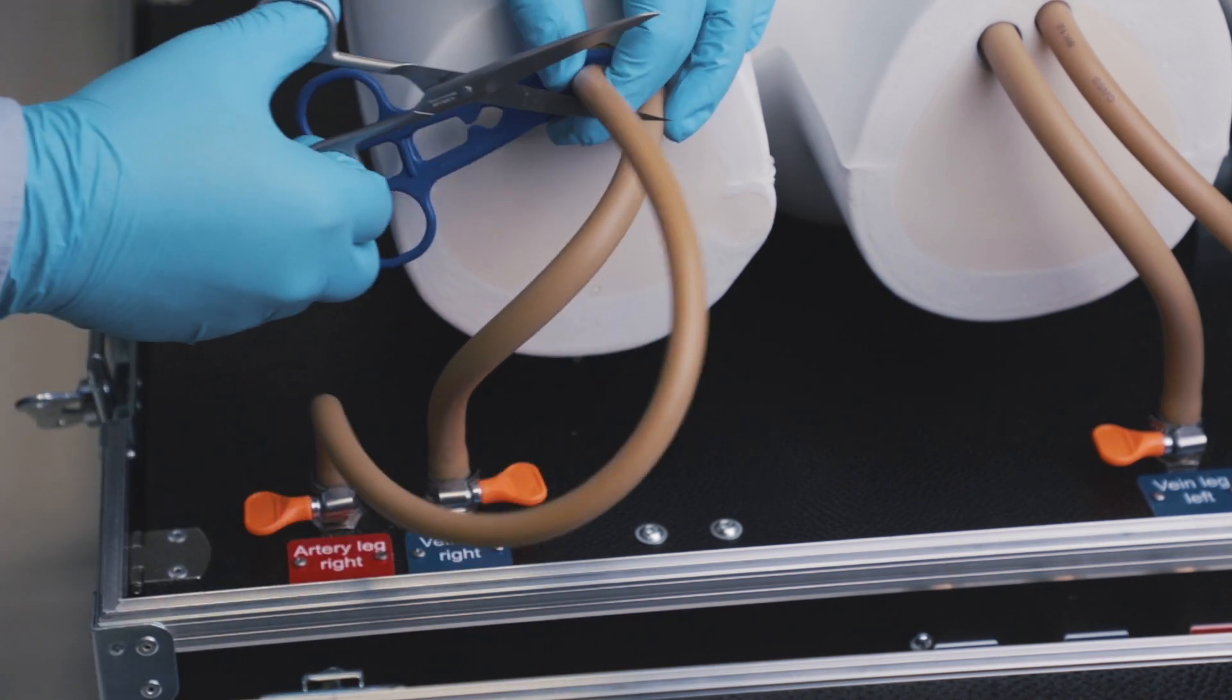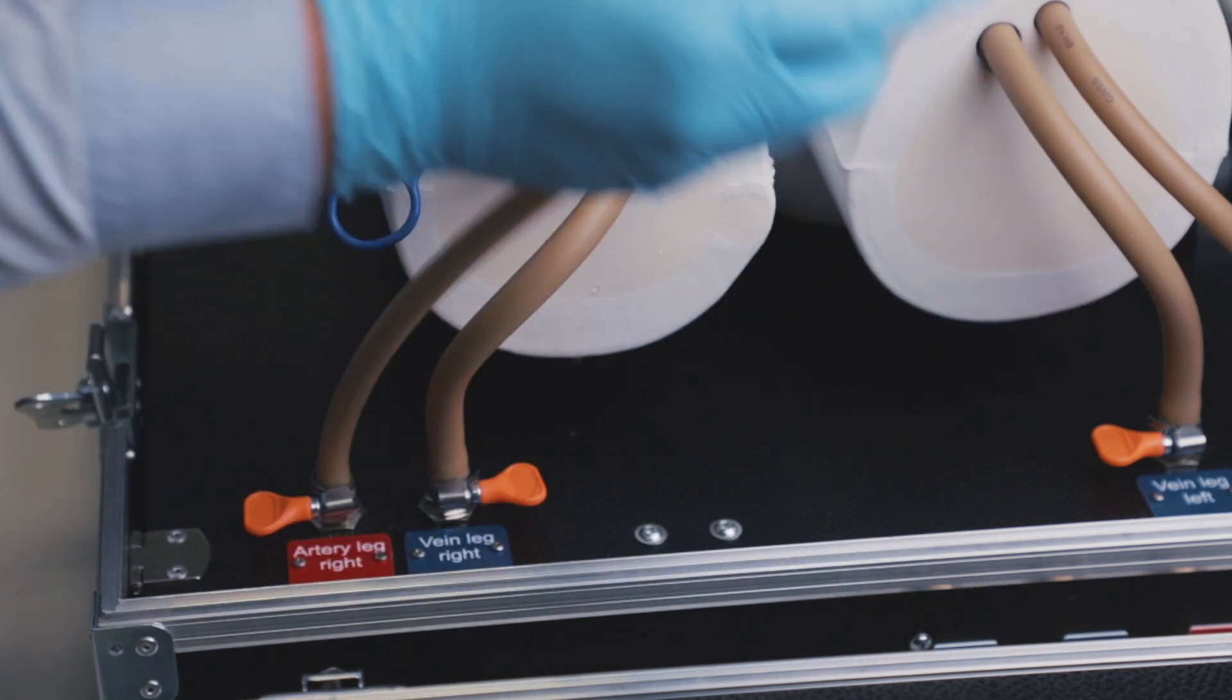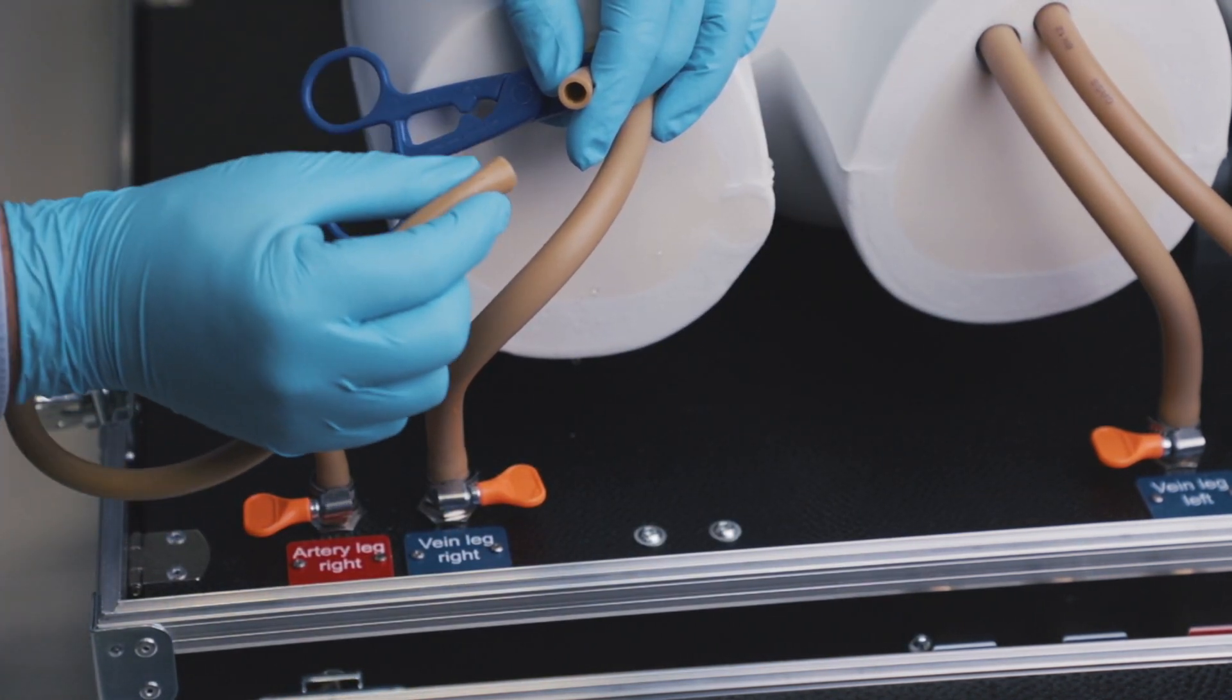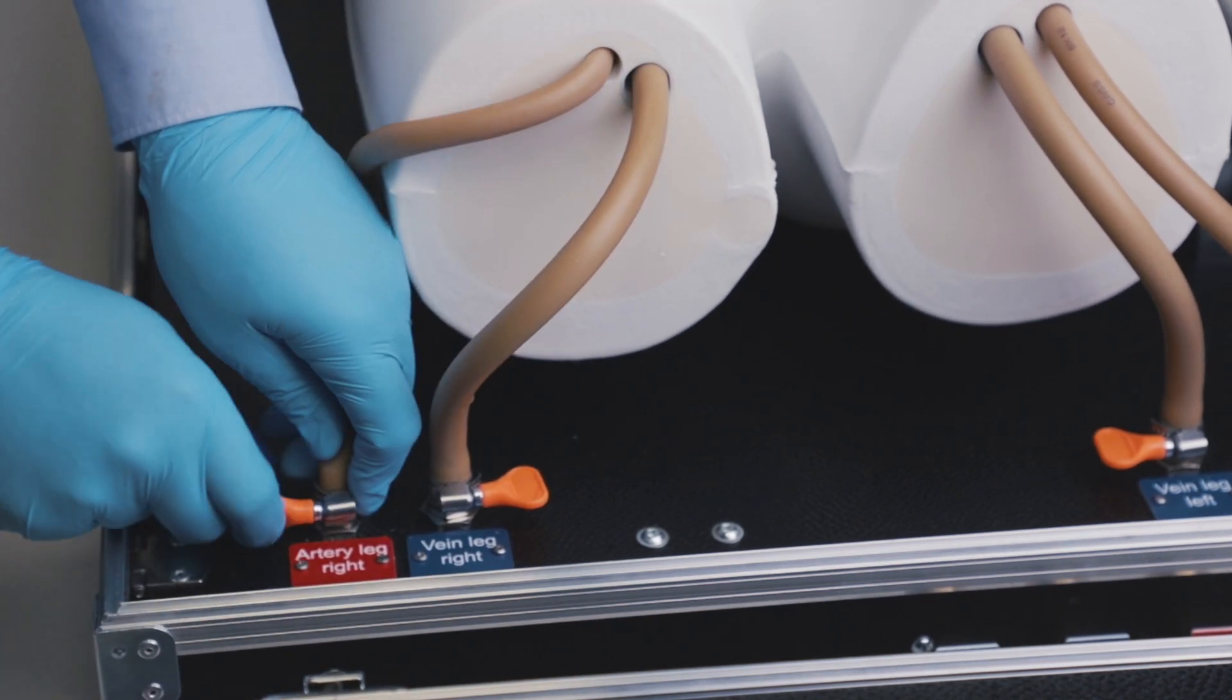After each puncture, the tube is pulled out and cut off to remove the big puncture hole that is produced during the training process. The tube can be pulled out about 10 times until it needs to be replaced.